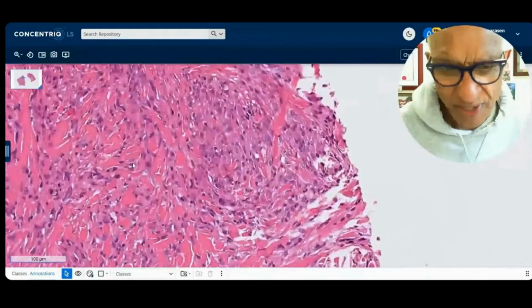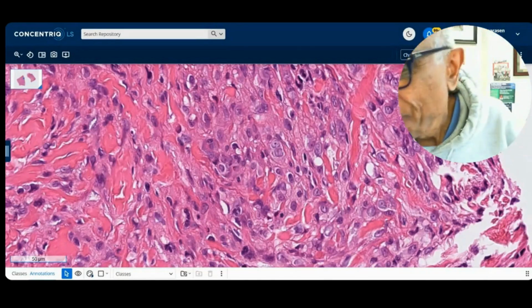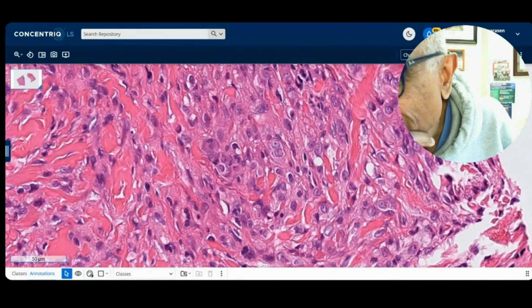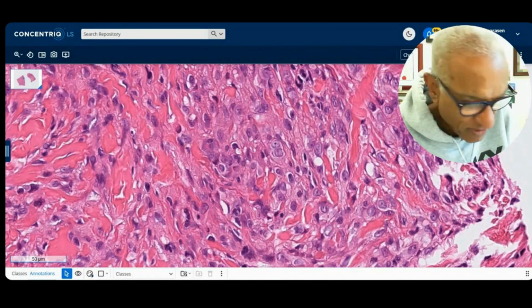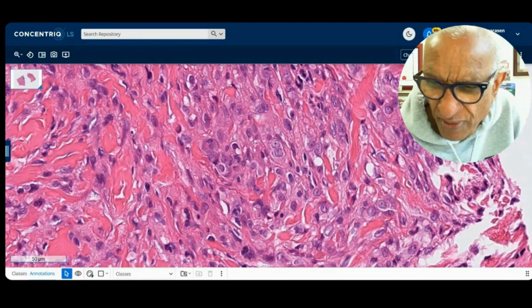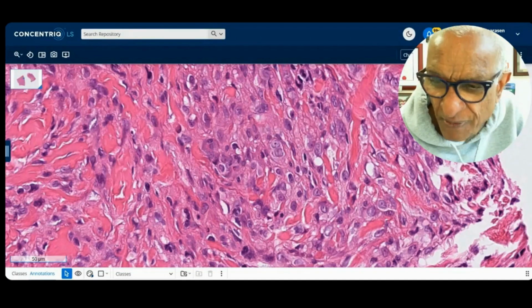But let's go back to the tumor cell morphology. I just want to hear how you would investigate this in the scrotum. Right. Okay, we're getting some very good comments. Albertul's online, so that's good. Reminiscent of mammary type myofibroblastoma with the collagen bundles. I hear you, and that's a very good thought. Remember that you can get mammary type myofibroblastomas, extra mammary myofibroblastomas, in that area as well, in men as well. He's a man, he's 41 and he's male, so you can get that.